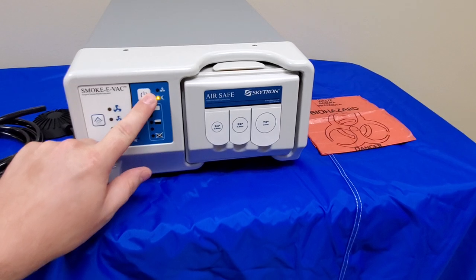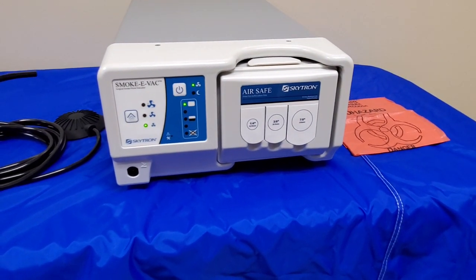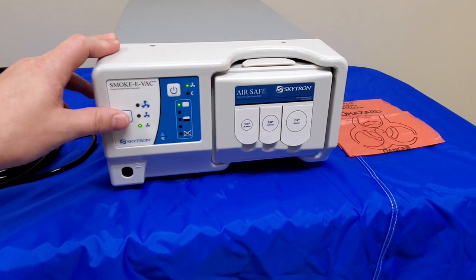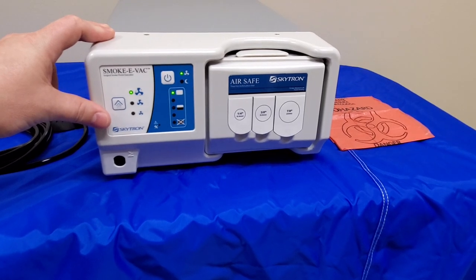This unit can also be operated in constant mode. Press that power button and it goes into constant mode. If you need more flow, press the button to turn it up.